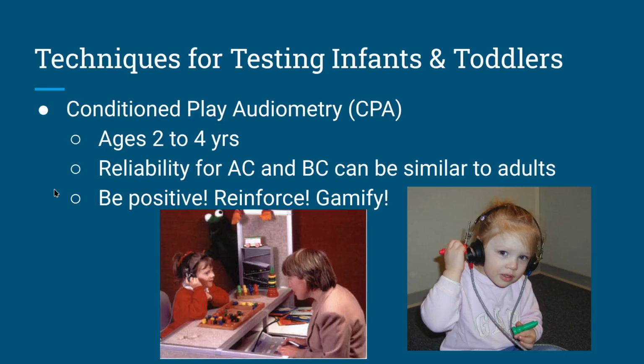Techniques for testing infants and toddlers. You have conditioned play audiometry for ages 2 to 4 years. Reliability for air conduction and bone conduction can be similar to adults. Be positive, reinforce, gamify. Children are receptive to structured play at this age.